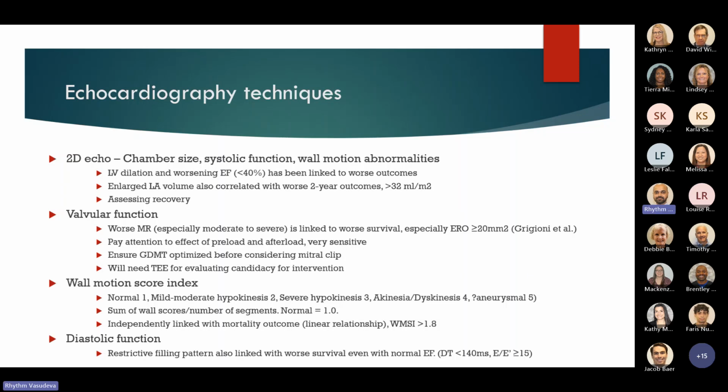The last would be, we mentioned diastolic function is actually one of the early pathologies that occur from ischemic heart disease. What's been shown is a deceleration time of less than 140 and an E/e' of more than 15. That has been linked with worse ischemic outcomes over time. And all these hint at how well your medications are working and whether you need to do anything additional to support their heart failure care.